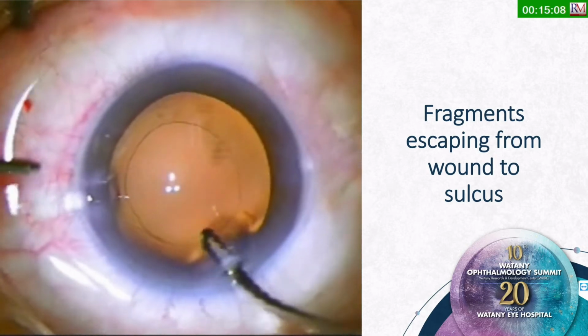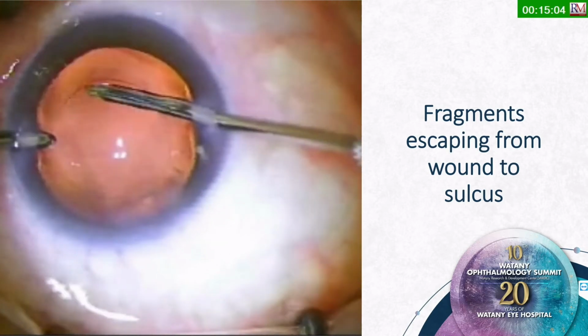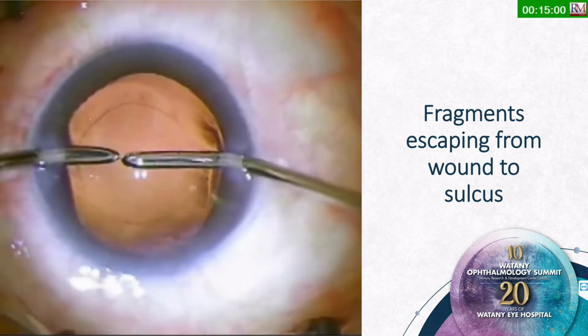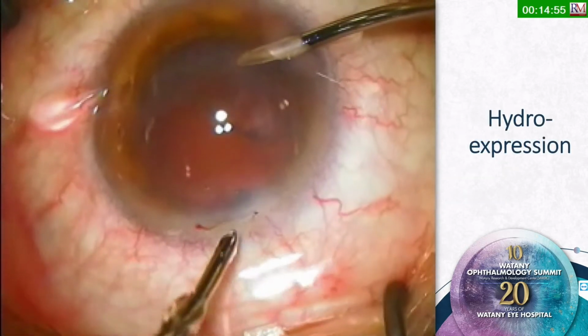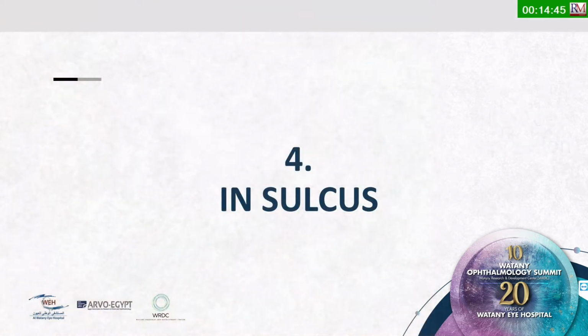One of the mistakes is to irrigate the corneal wound, hoping the fragment will go away. Actually, it went from the wound into the sulcus. The right way to wash it out is to introduce the irrigation at one port and press, to get a gush of fluid into the corneal wound to wash the fragment out. This we call hydroexpression. And now the most important part is the fragments that are hidden in the sulcus and become invisible.